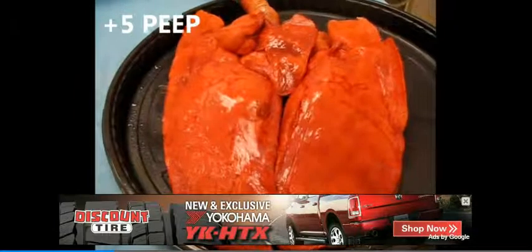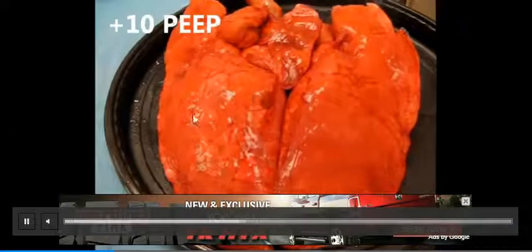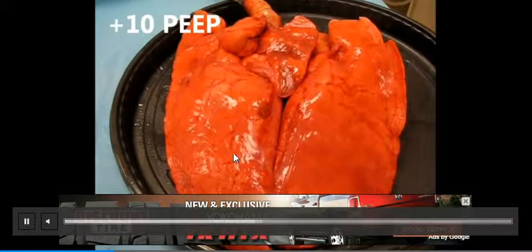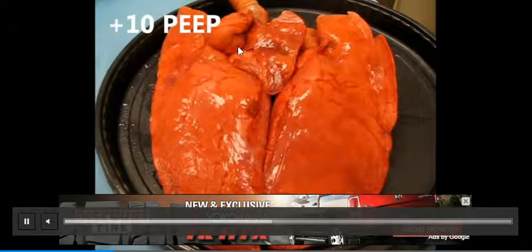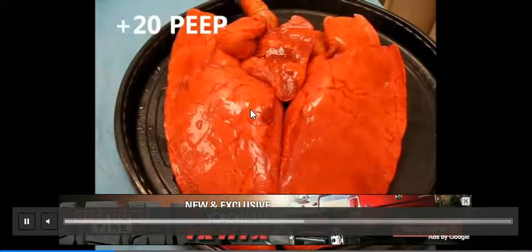Now we're going to add some PEEP. And look, we get a little bit of recruitment. We get a little bit of color change. Look at that. Now we're adding 10 PEEP. You can see stuff start to pop up. The lung is getting more recruited and more recruited. The color's starting to come back.